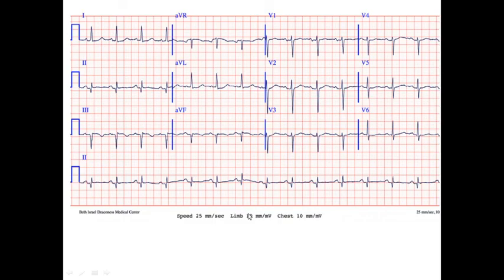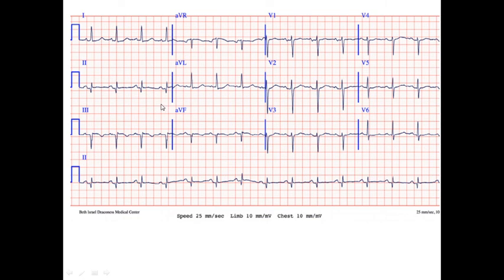Let's discuss the ECG of a real patient. For example, we got an ECG like this, and now we know what we should do. At the beginning, we should assess the regularity of rhythm, and then assess whether it is sinus or not. To assess sinus rhythm, we should find the P wave — look for a P wave before the QRS complex. You can see here there is a P wave present before the QRS complex everywhere. That's why our rhythm is sinus. Next, is it regular or not? You can see RR — about 3.5 big boxes between the RR intervals, which are similar, so the rhythm is regular.